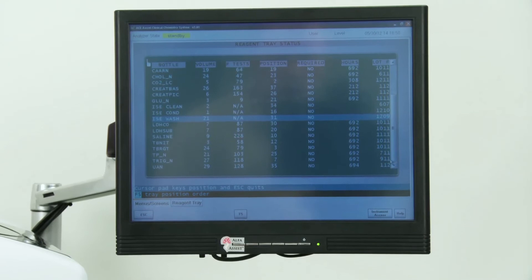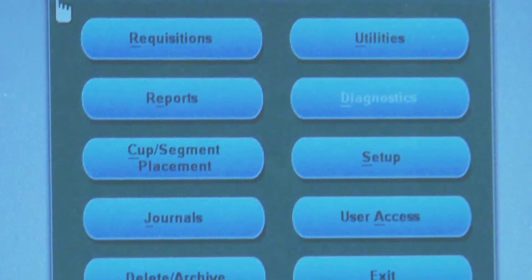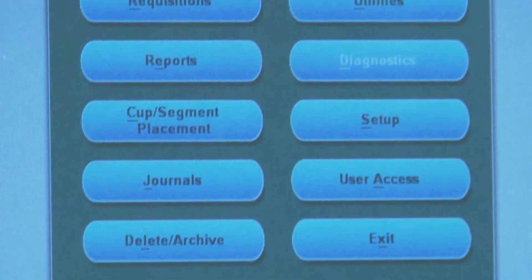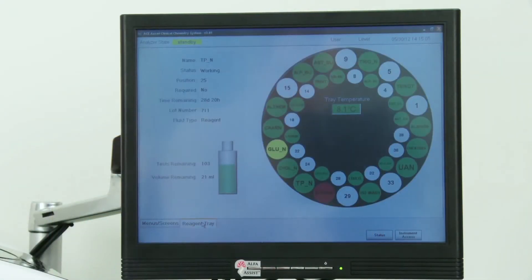The ACE-XL uses a touchscreen, Windows-embedded, all-in-one PC. The system has an intuitive interface, allowing users to quickly navigate the system. Instrument operation takes just the touch of a finger, even while wearing gloves.